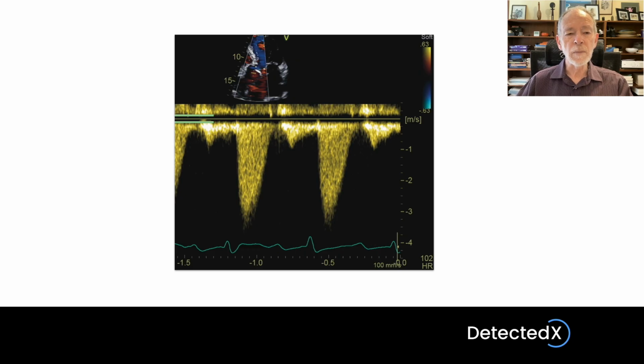The other thing is that I placed a pair of green lines on the left-hand side around the baseline, indicating where the wall filter has removed the echo signal. So you'll notice that there's a dark band around the 0 Doppler shift baseline, and that's because that's where the wall filter has removed Doppler shift signal.